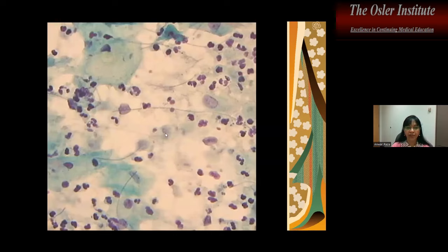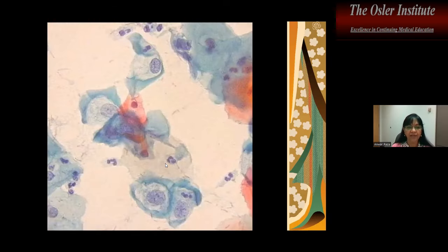Here we see trichomonas and leptothrix, and an inflammatory background, a sort of dirty background here, and the nucleus will be enlarged. And the most prominent perinuclear halos would be with trichomonas infection, but you don't always see them, but there's a little bit of a hint over there, right, of that.